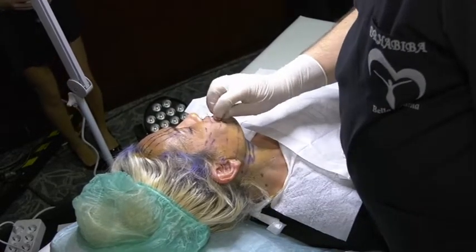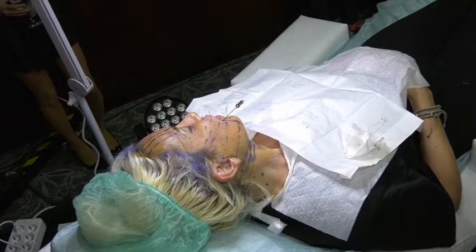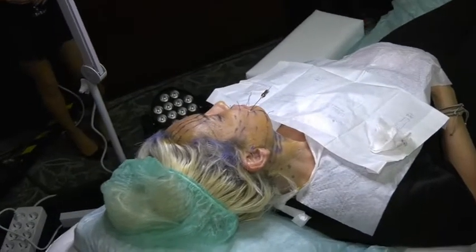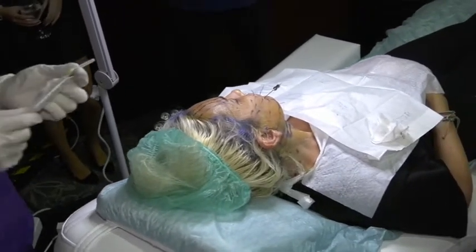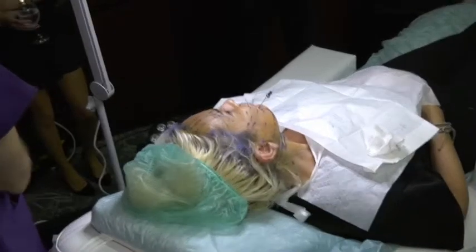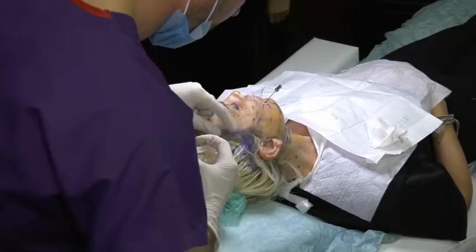Okay? Make sure before you are subcutaneous. I see a lot of people do what? They enter the cannula and do like that. What is this? Really, 90% of the doctors, they do like that. You think that you will be okay, you will feel it, but you will not know if it's wrong or right or where it is. You will feel it, that's correct, but you cannot do that.